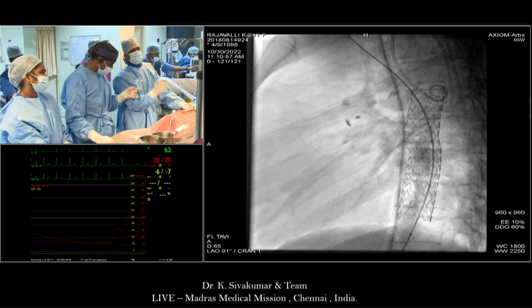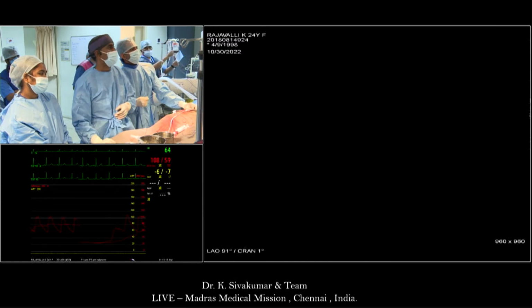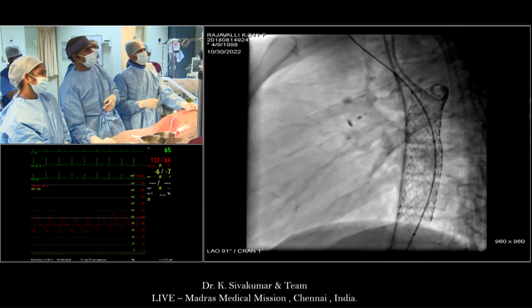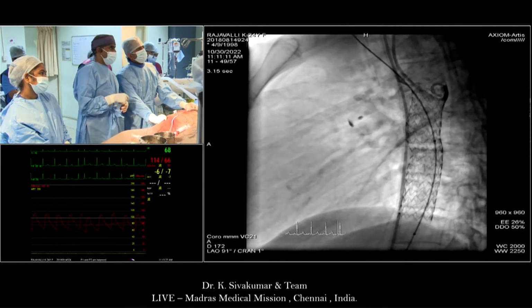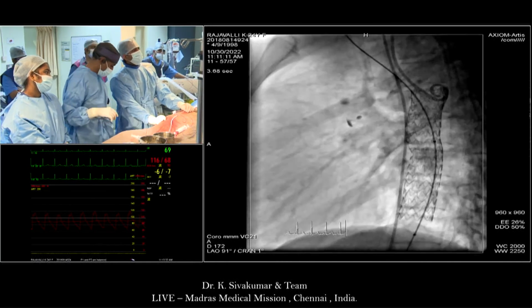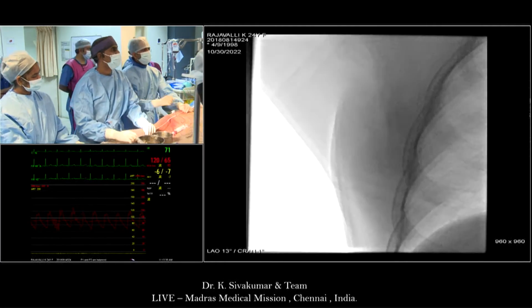Okay. Now inject from the top. Inject from the top. Pressure is back. Shoot. Okay. Actually, I have covered the pseudoaneurysm, but there is a lower dissection flap. Come to AP view now. AP view. You are holding.